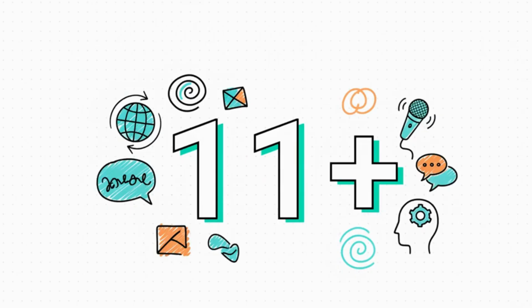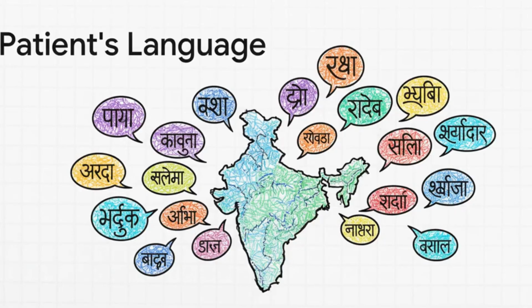And here's maybe the most incredible part of this whole thing. It does all of this in more than 11 different languages. This right here is the key to making it truly accessible. The AI can have this entire conversation in Hindi, in Tamil, in Gujarati, and a whole bunch of other regional Indian languages. It completely shatters one of the biggest barriers to getting good care, making sure every single patient can hear their diagnosis in the language that they know best.